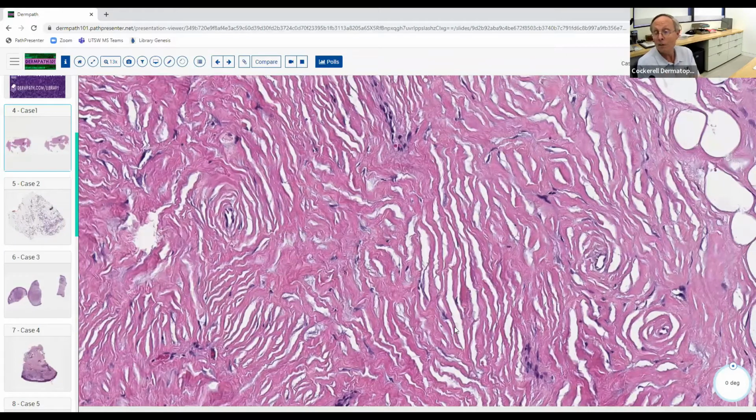histologically. If you see this, say on your board examination, it's probably too mundane to show on a pathology board examination, but if somebody decided to put it on there, just remember that it's associated with Cowden syndrome. You might take a moment or two and bone up on what that syndrome is associated with. It's autosomal dominant, associated with, I think, mostly GU and GI cancers. Maybe breast cancer too, but mostly GI and GU, as I recall.